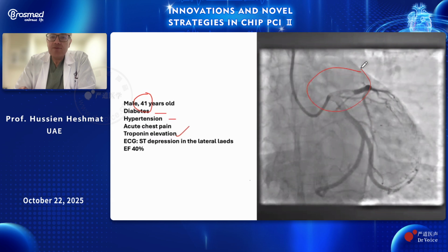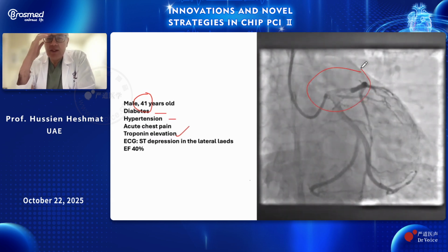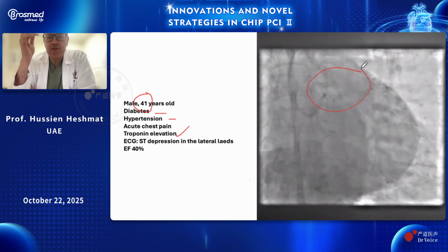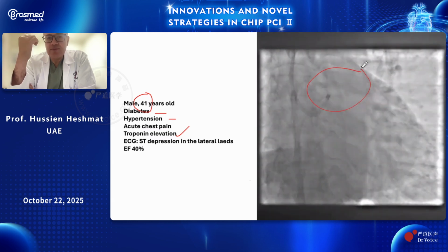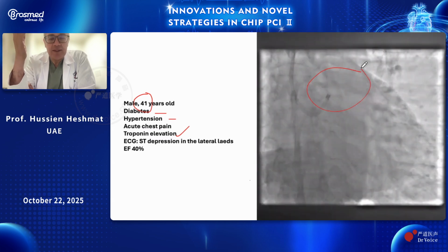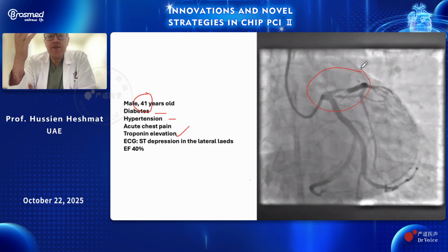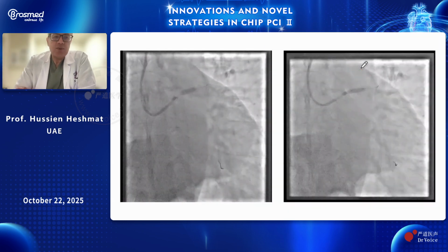And so we learned from the previous cases that when you have a large vessel, you can go with an NC balloon. But if you want proper modification, if you want to save time and you want to save devices, the plaque burden in the large vessels is significantly bigger. So it's good to go with a scoring balloon from the beginning. And that's what we did here.